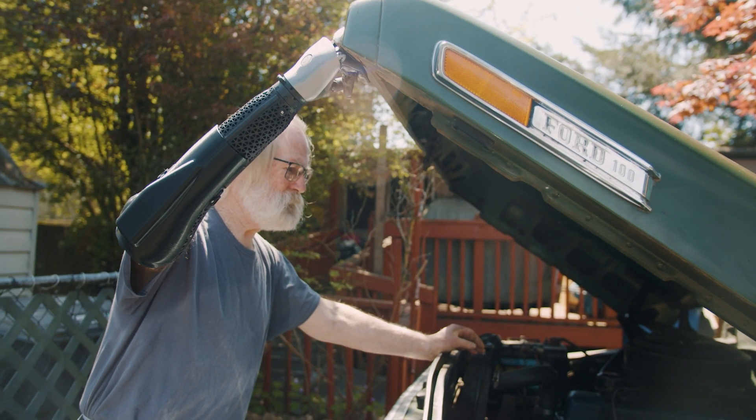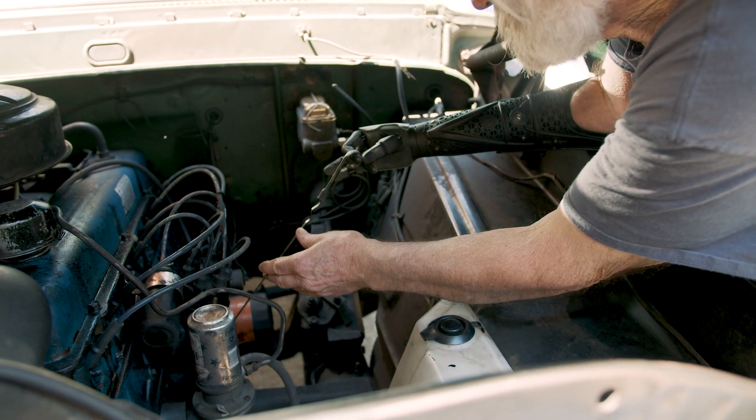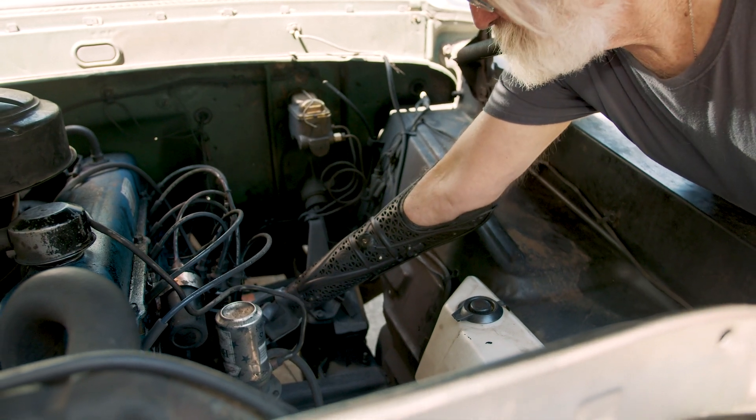Building a pickup truck for myself — I always wanted to build a car. Hero Arm has boosted my confidence. Like, I can do this now. I can do that. I don't want to look like everybody else, but I want to have the functionality that everybody else has.